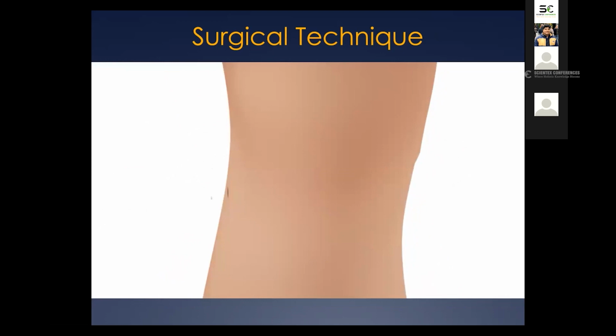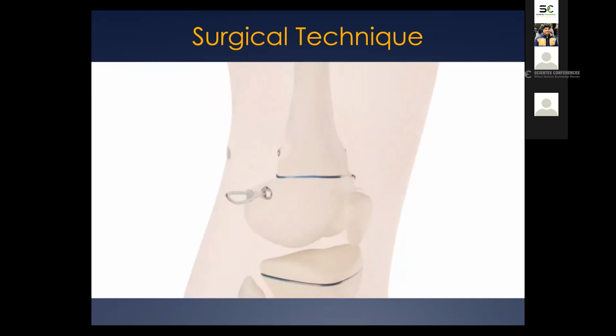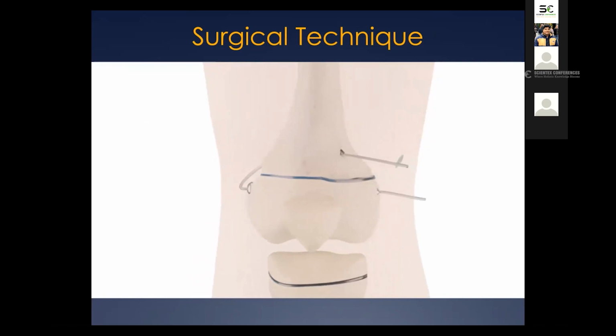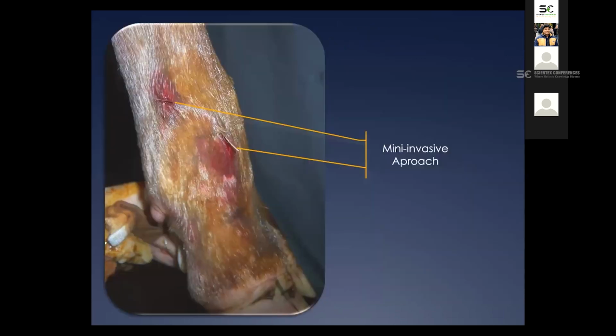Passing the cable is a little bit tricky. It is done like this in order to keep the surgery as less aggressive as possible. And this allows you to do the whole surgery with just these two very small incisions. This is the final appearance of the limb after surgery.